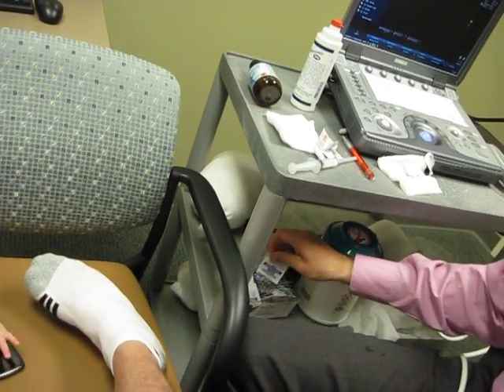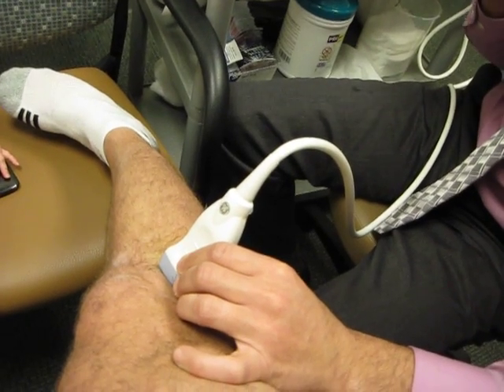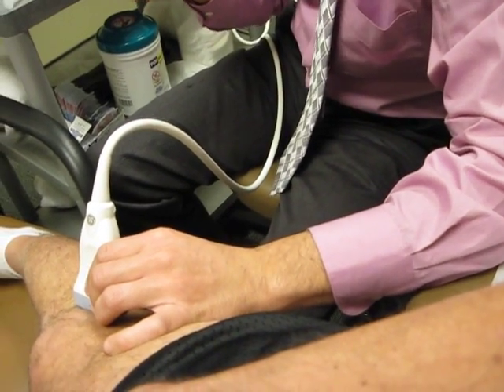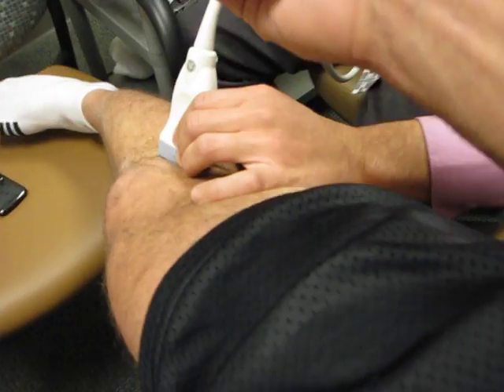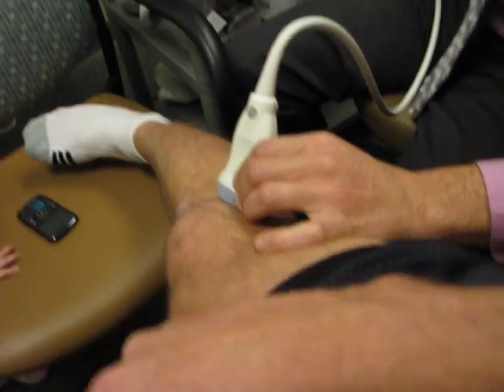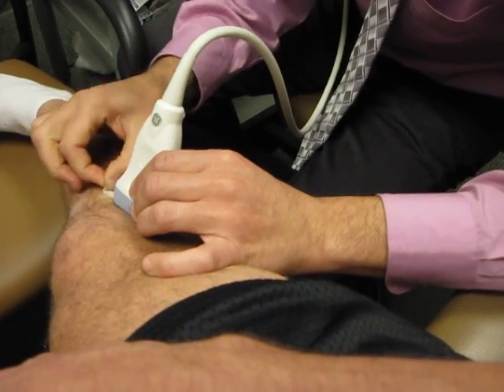So there's two places where this hurts. It's on the femoral condyle — that is where it hurts most of the time. And the insertion is where I was getting it. Do you want me to open it for you? Are you ready? If you're taping that, tell your student that's not a good offset.